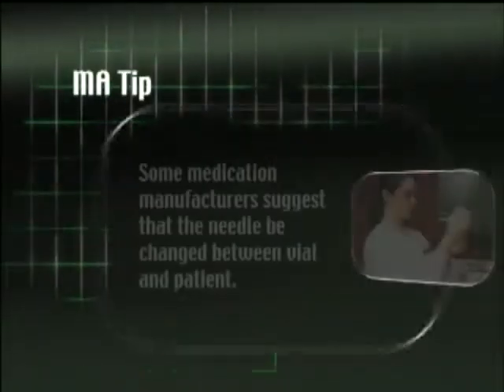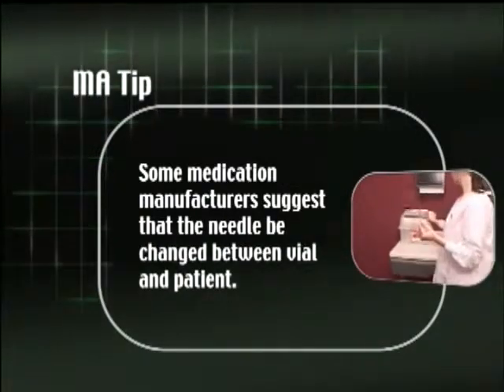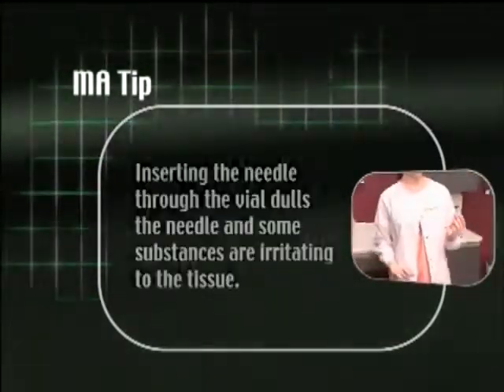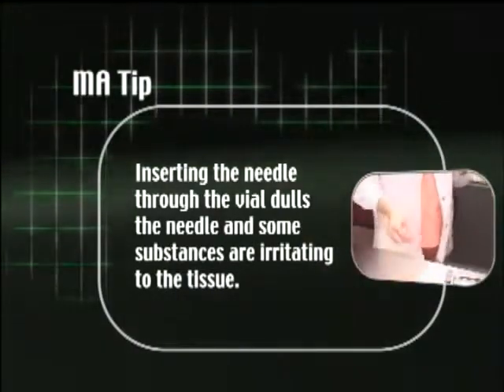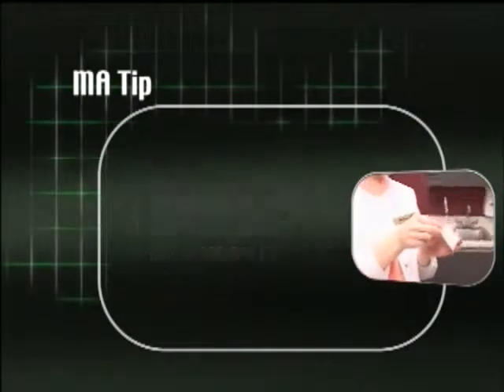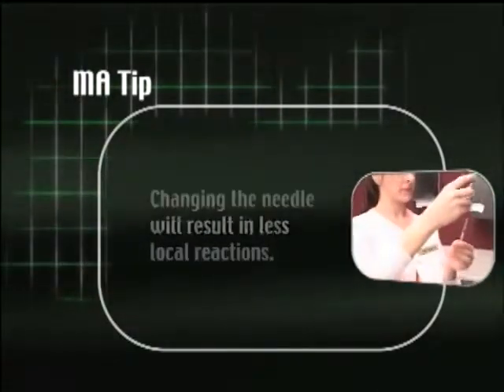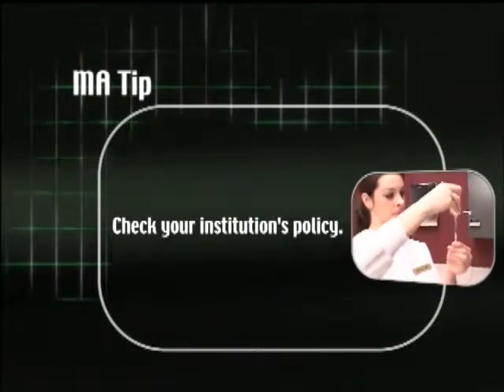MA tip. Some medication manufacturers suggest that the needle be changed between the vial and patient. Inserting the needle through the vial dulls the needle, and some substances are irritating to the tissue. Changing the needle will result in less local reactions. Check your institution's policy.